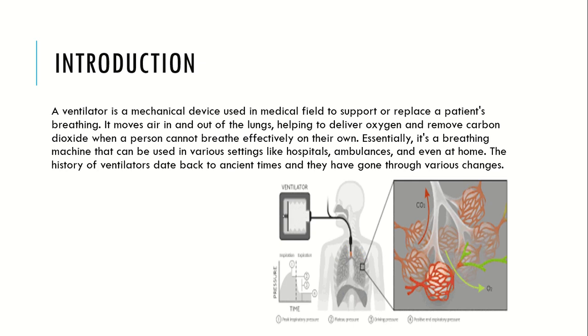A ventilator is a mechanical device that helps us to breathe in case our breathing is low or we need help to breathe. In many cases it is used in ICUs for people who can't breathe normally because of complications of a surgery, or because of their age or infections, etc.